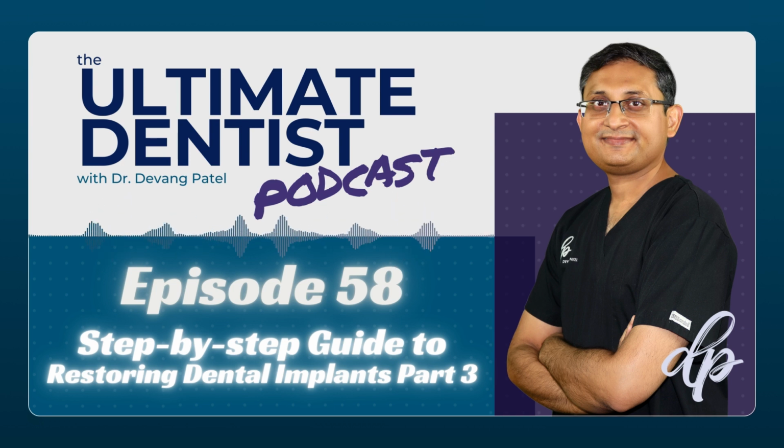You then need to specify what type of restoration you want. Do you want cement retained or screw retained? If you want screw retained, do you want a UCLA type one piece implant crown, or are you happy with a screw mountable? This is something you need to pick up the phone and discuss with the technician, and then you just need to tell them once, and hopefully they will do the same thing for the rest of the restorations. Then you need to tell them what type of occlusion you prefer, and this is something we will discuss in the next episode. I'm going to discuss the fit and the occlusion, what type of occlusion you want when you're doing implant restoration.